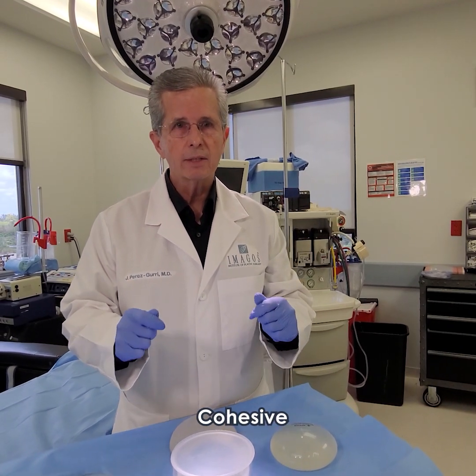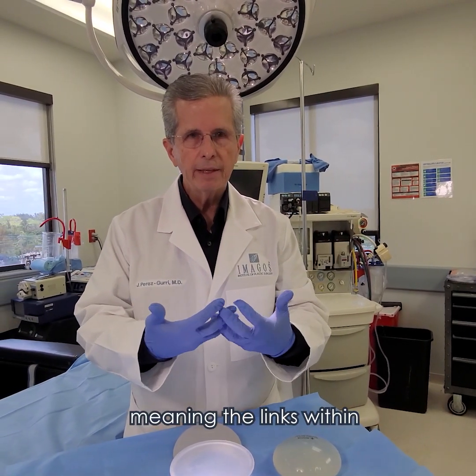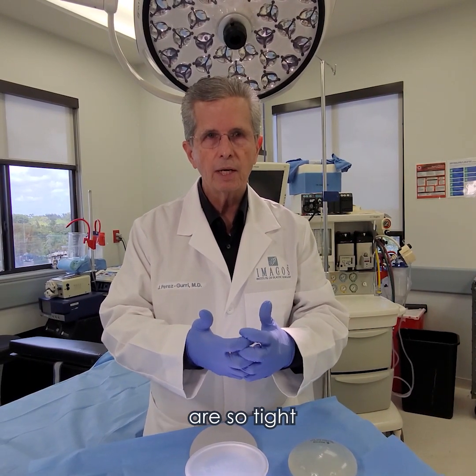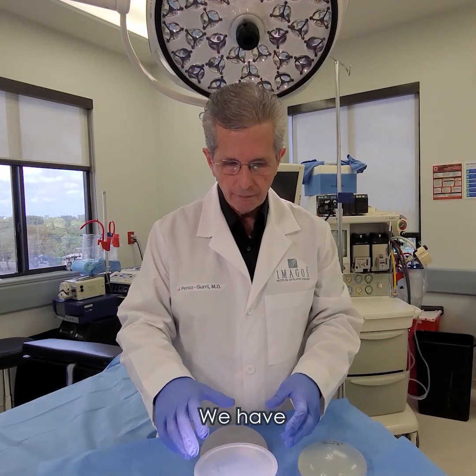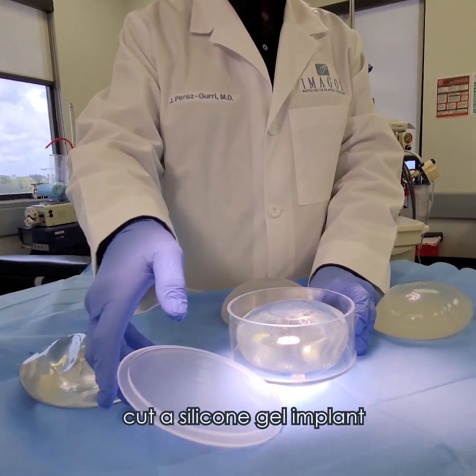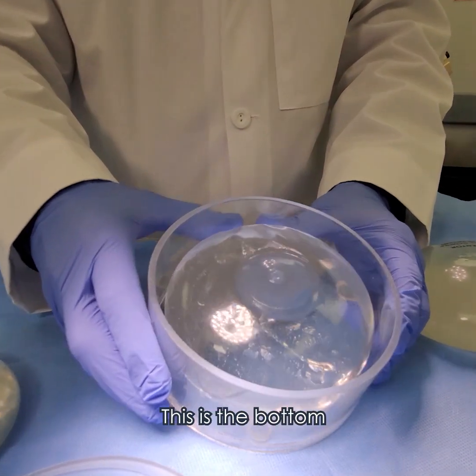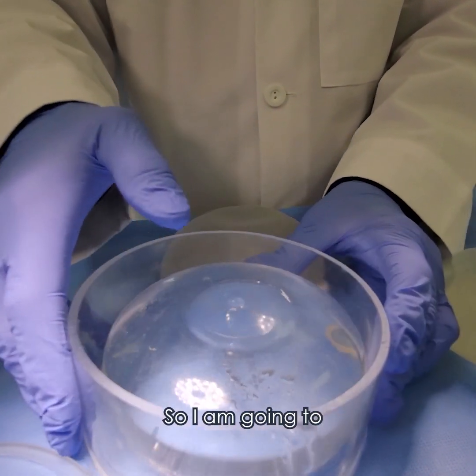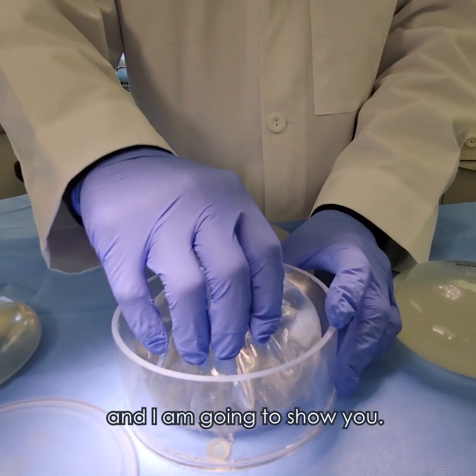This silicone gel today is cohesive, meaning the links within that cohesive gel are so tight that it doesn't go anywhere. We have on purpose cut a silicone gel implant on its superior surface. This is the bottom where you can see it has the texture and everything. So I'm going to take this out and show you.